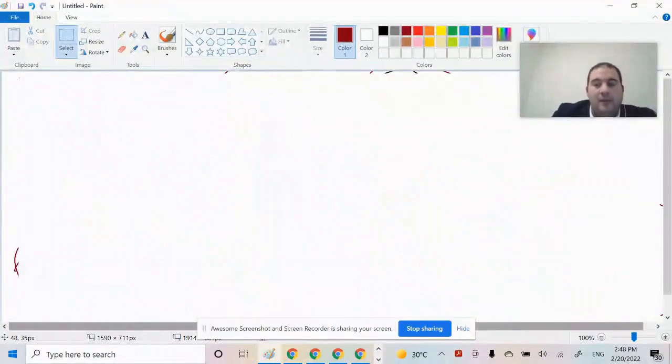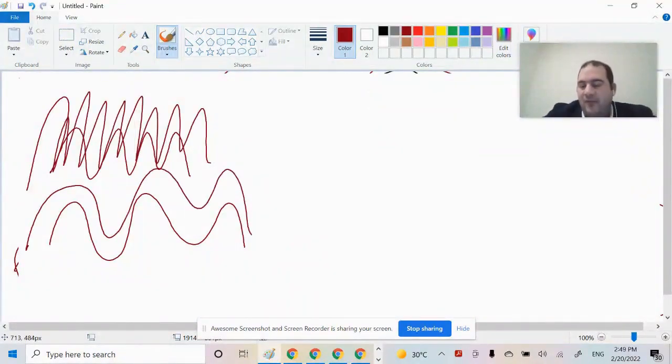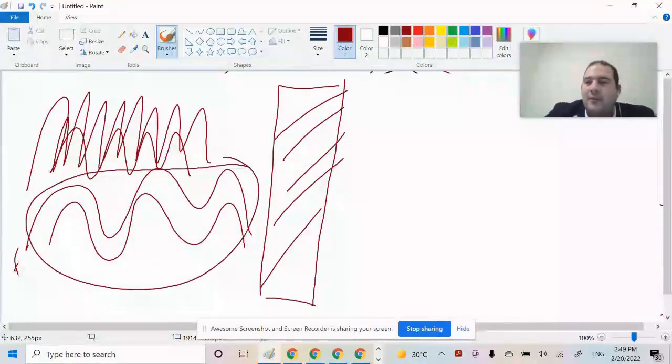X-ray produces different energies, such as 10, 20, 30, 40, which we refer to as polyenergetic. So you have photons with high energy, and photons with low energy, and some with very high energy, giving you a range of energies. Now, when I place a thickness of a certain material, let's say lead, this thickness will start to remove the soft radiation, which are the initial energies, for example, from 10 to 20. So, who will pass through?